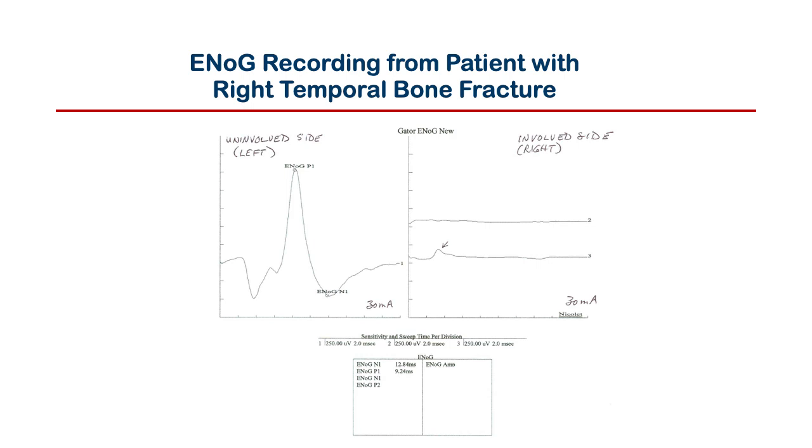Here's another example of a really good looking response on one side, no response on the other side where there's a temporal bone fracture.